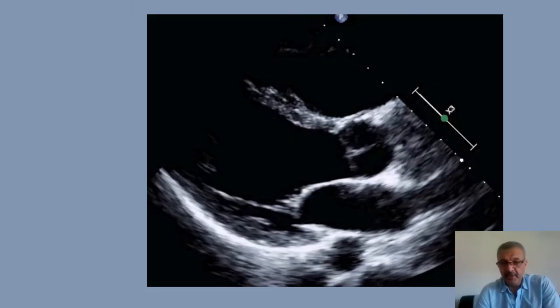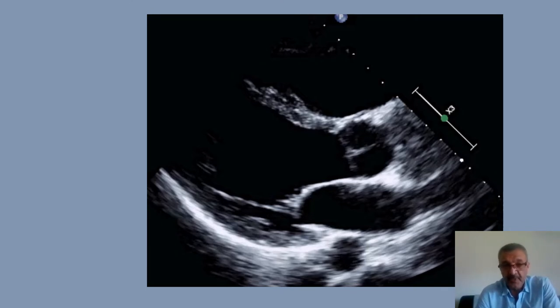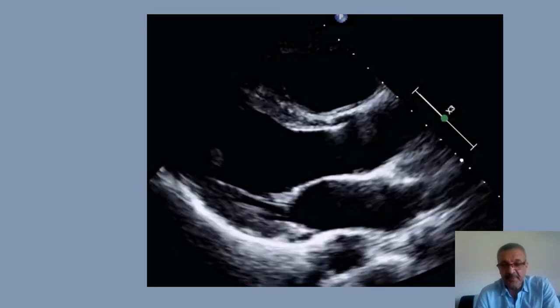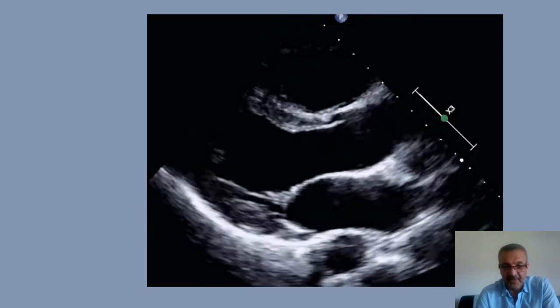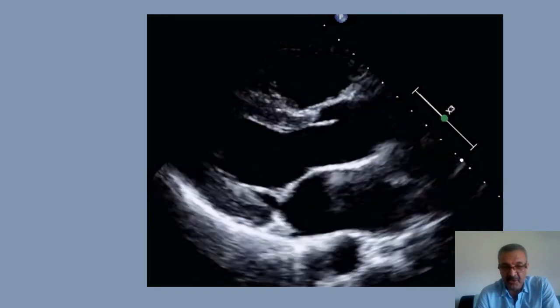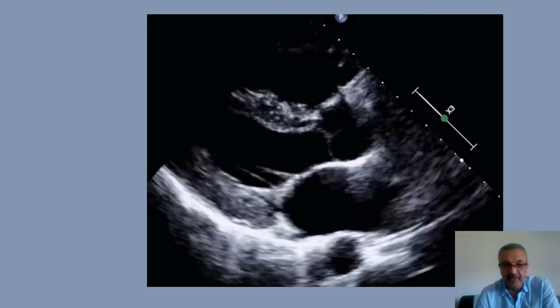Now let's see how we solve those problems. First, I want to explain what criteria make a good PLAX image. A good PLAX: first, optimize the depth so that the area of interest — the posterior pericardium and aorta — shows up on your image.